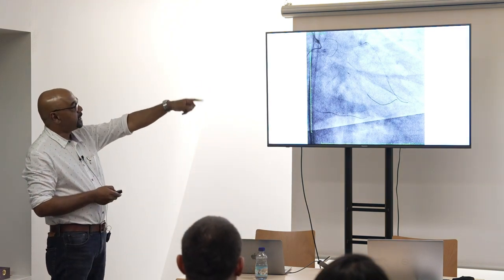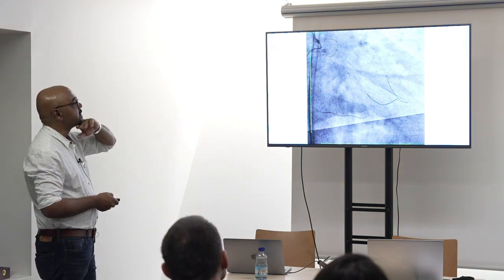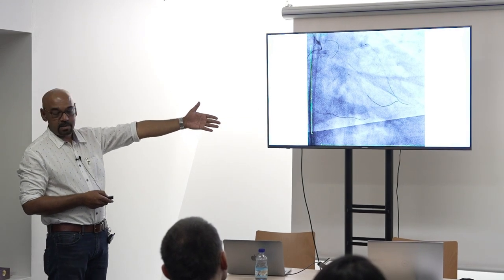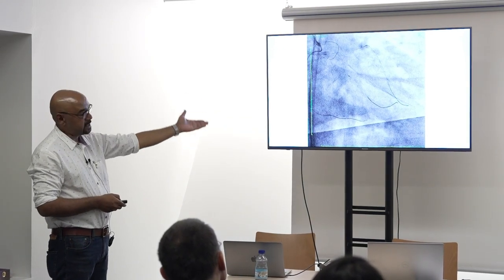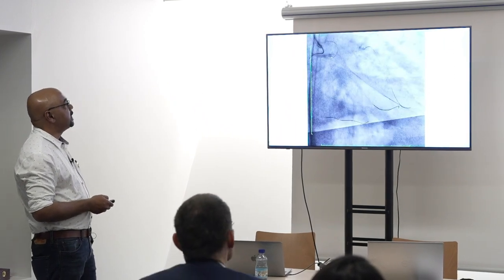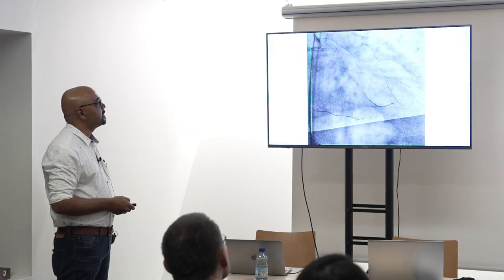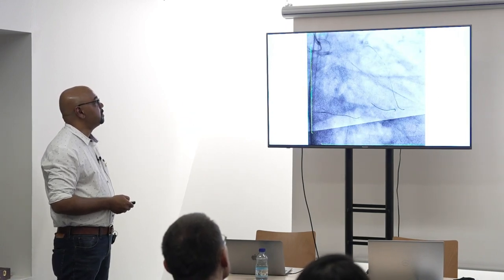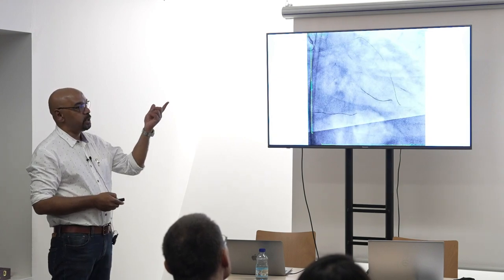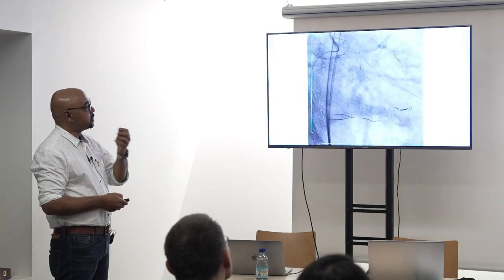Because I had kept one wire in the LAD, just to be sure, because the entire left main was diseased. So I realized that probably the collateral circulation is getting compromised. So then I stopped the RCA and went to the left. And strangely, the left main LAD was not a problem. There was an OM which had a very, very bad disease, which we could not cross with multiple balloons, even with an anchor. So this was again a 0.75 Alveo, which managed to cross.